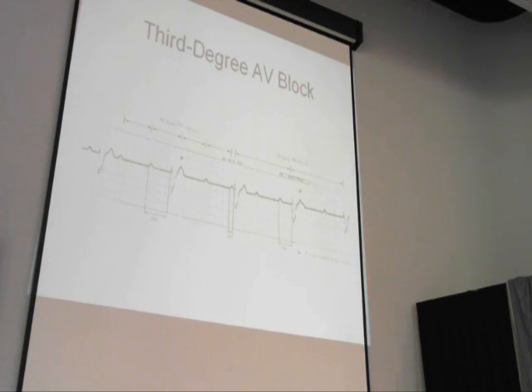That's not enough to maintain blood flow to the brain and kidneys. It's like we're divorced, we can't afford a new house, so we're living in the same house, but we ain't talking, nothing conjugal going on. We're just there, no communication whatsoever. You have a lot more P's than QRSs.